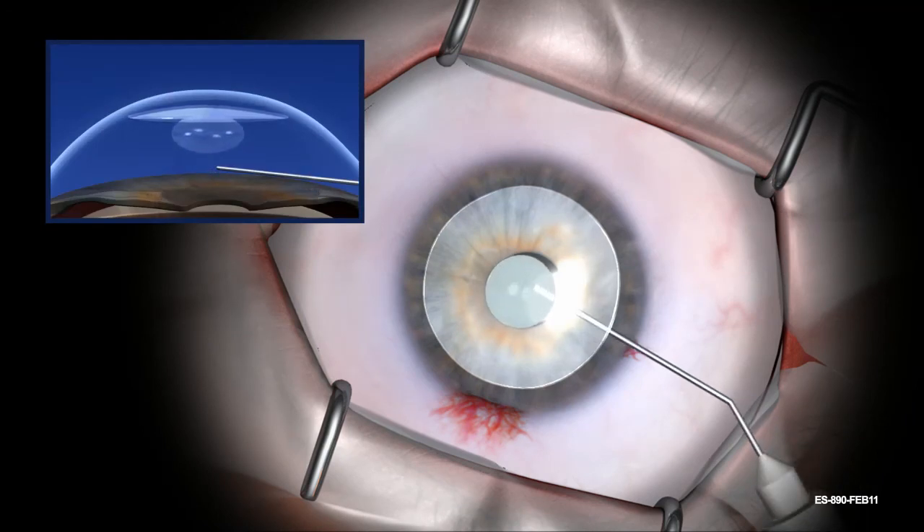An air bubble is placed to hold the tissue in position. For additional information, refer to the Endosurter's instructions for use.